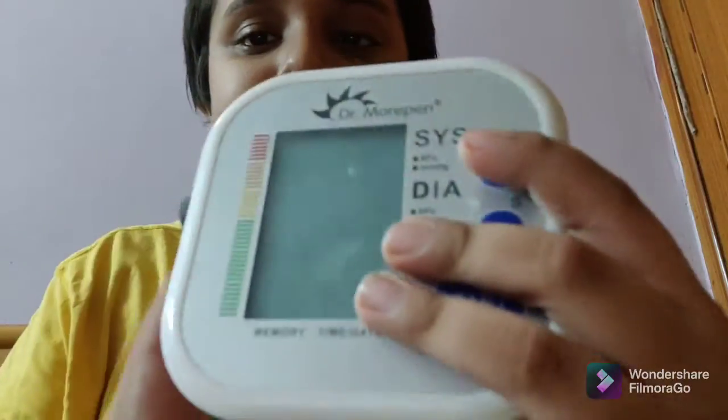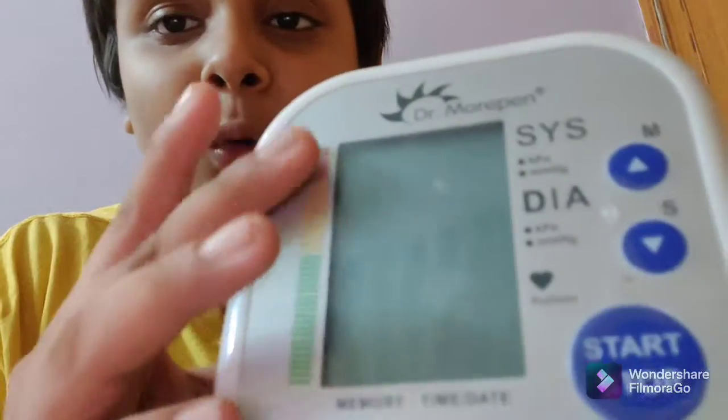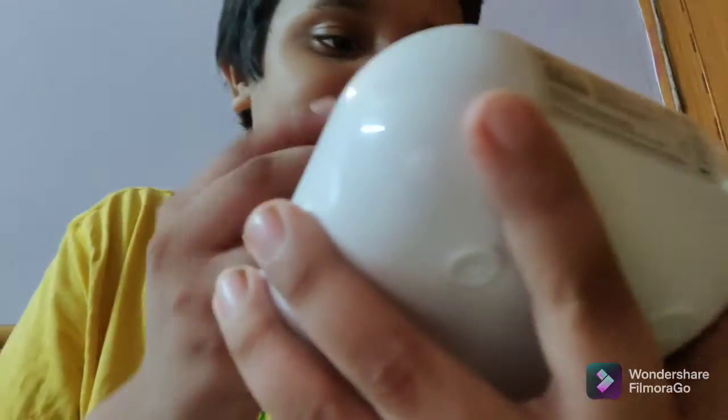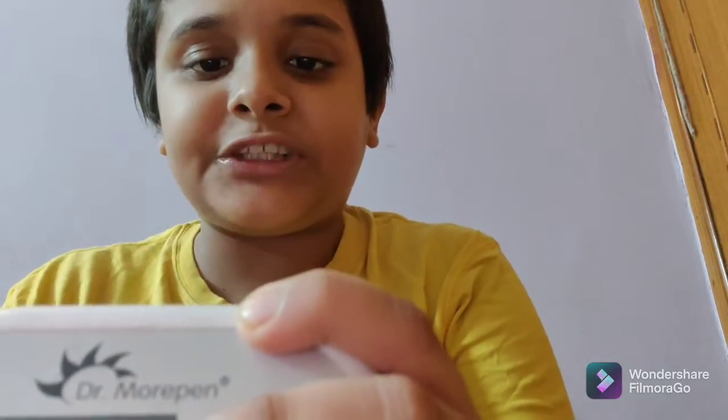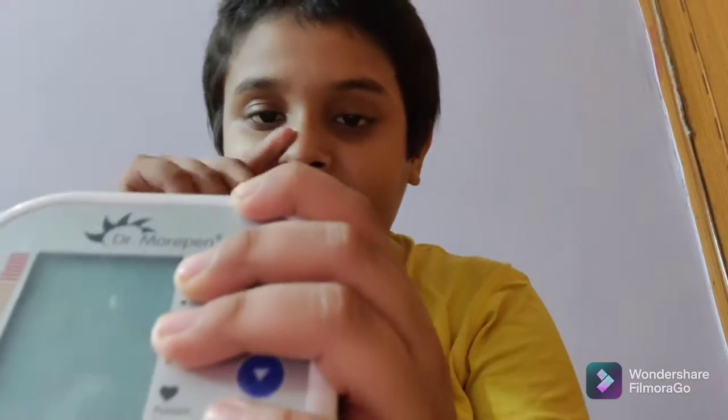On the back we get the Dr. Morpian branding with its logo. On the front we have the five-inch screen where you can see your BP, pulse, and monitoring rate. It has red, then two shades of yellow, and then green — I've never used these indicators so I can't tell you much about what they're meant for.